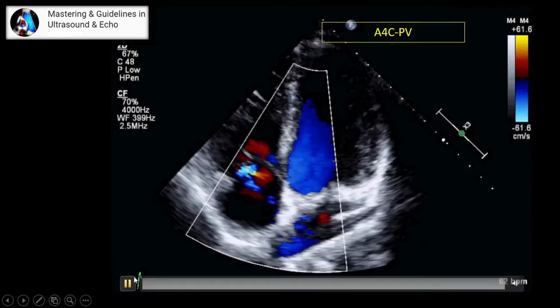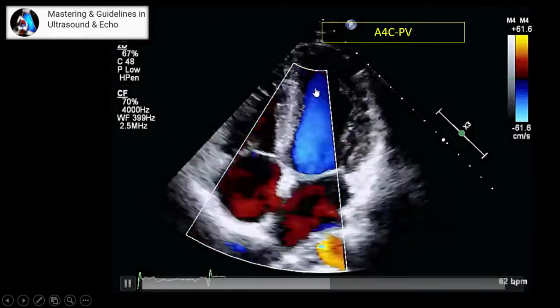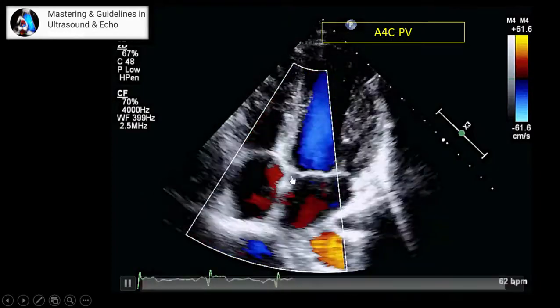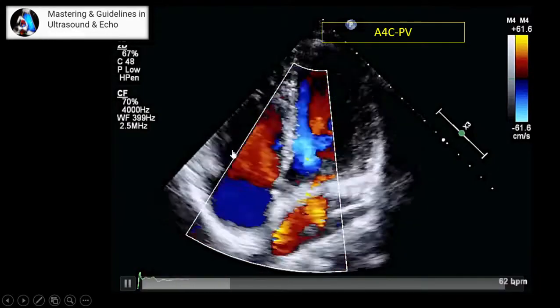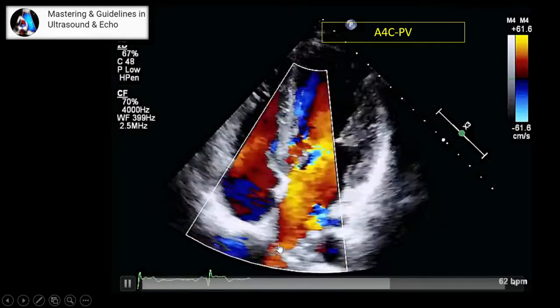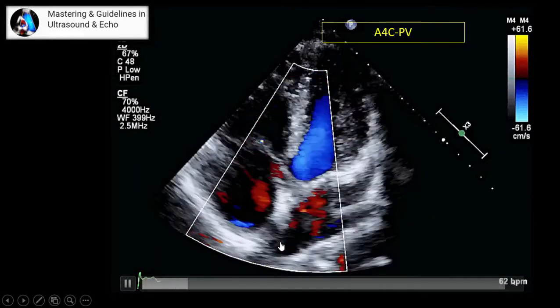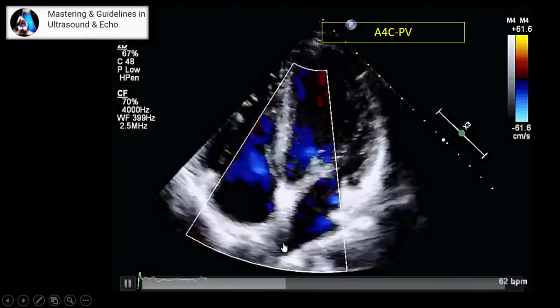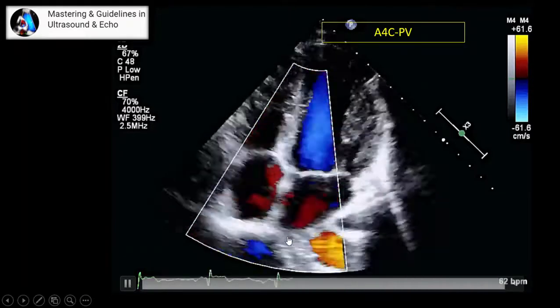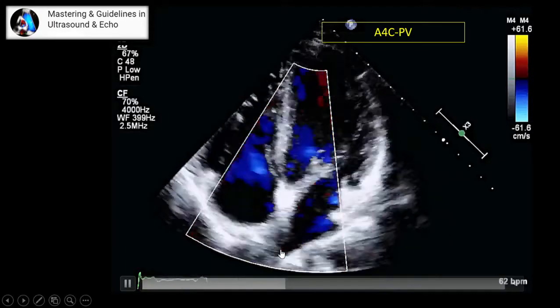After that, we go for the pulmonary vein. This color box is too much; we don't need it. I just want to show you how much blood flow there is in that area. We make it smaller and find the right superior pulmonary vein here. For finding this, usually from apical 4 you have to angle up a little, somewhere between apical 4 and apical 5. Suddenly you will see the right superior pulmonary vein here.